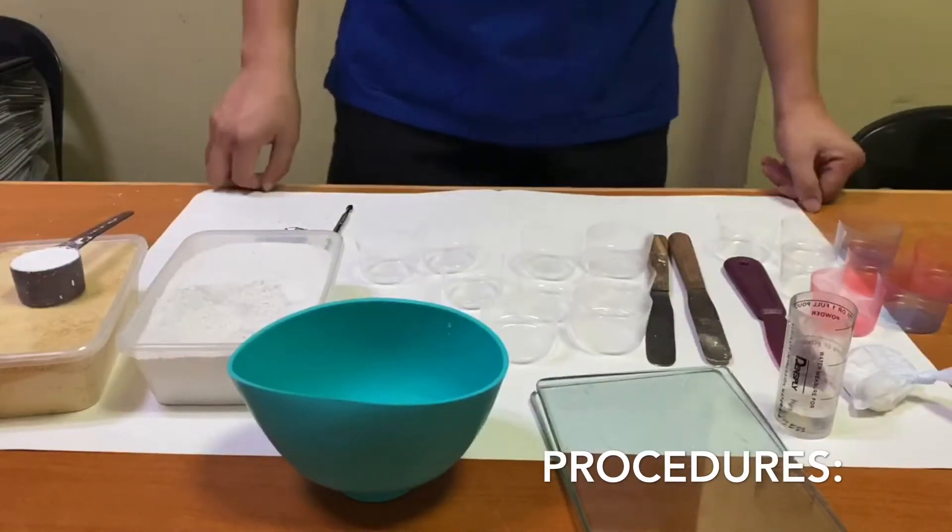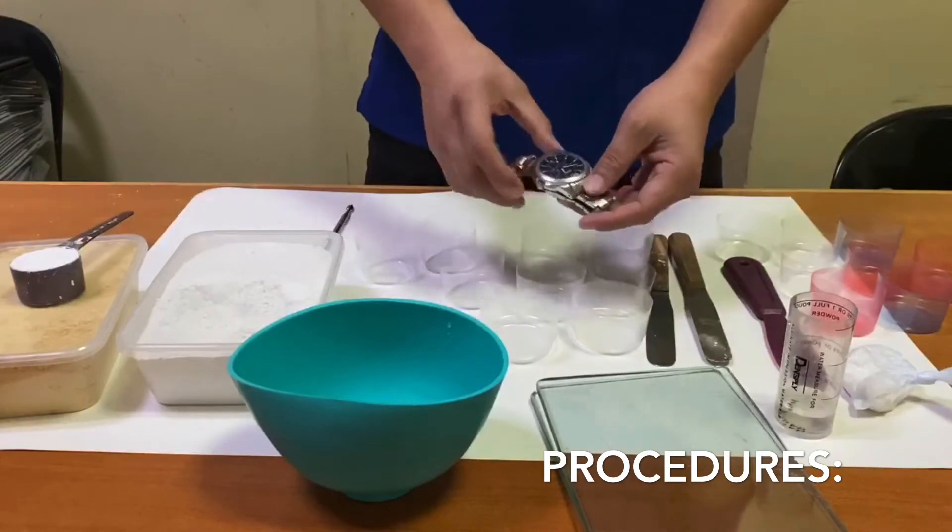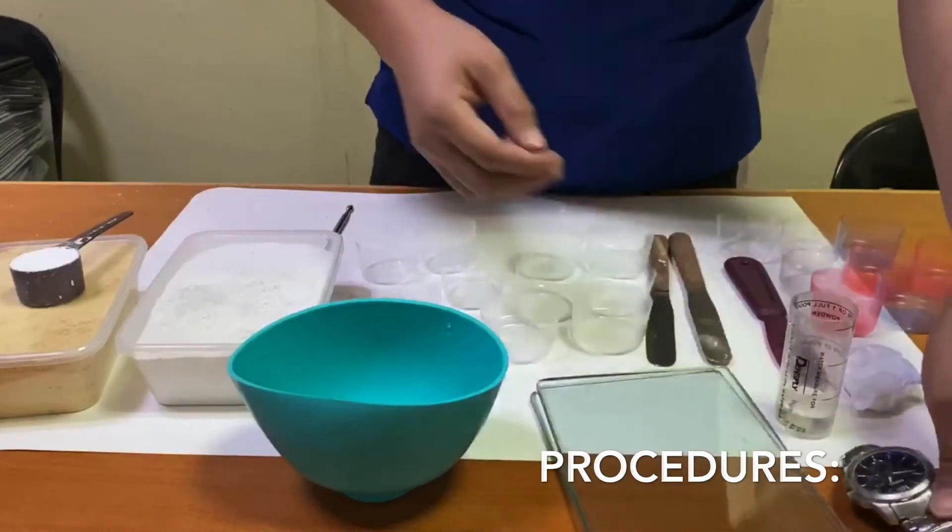Before you start the procedure, prepare your timer, set it at zero, and turn it on as soon as you start mixing.